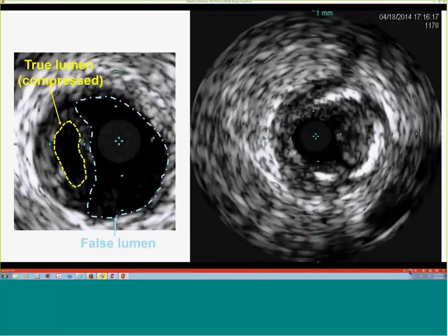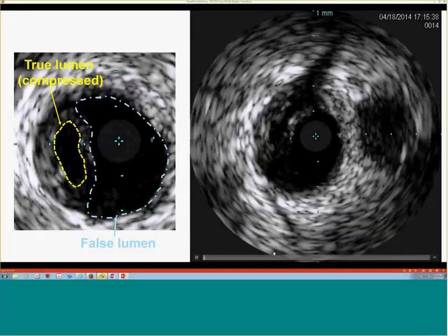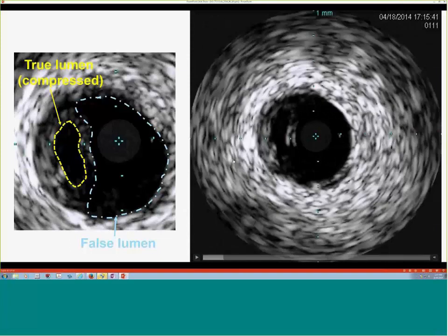So in my mind, when I see very dark and smooth, that makes me concerned. So what I want to see is, this one I think is fairly dramatic. If you look at here, you have essentially the vessel wall completely evolved and being here. And you see it's a very smooth line out between 12 o'clock and like 6, 7 o'clock. So if it's a vessel, you should have some intima there, some sort of plaque in there. This one looks perfectly clean. There's the media out here, and you have a perfectly nice and clean round vessel without any plaque in it.